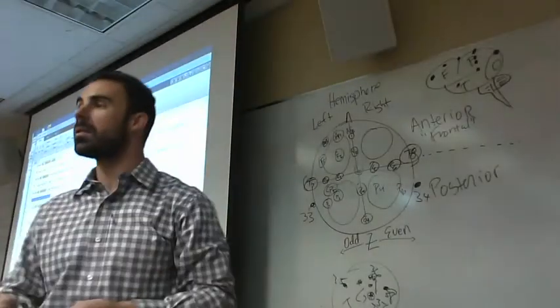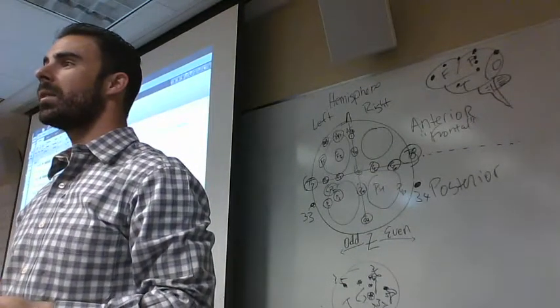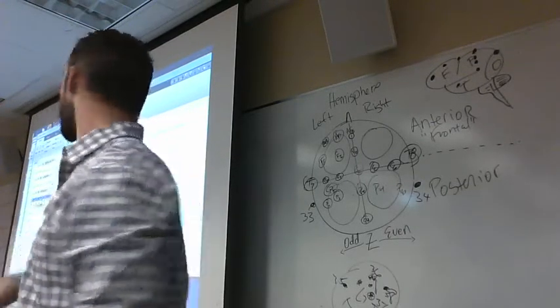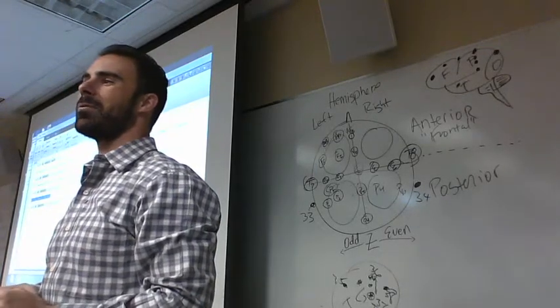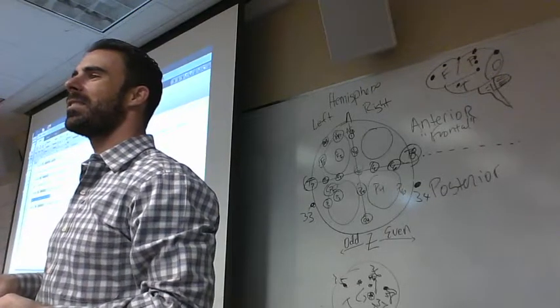You know how whenever we type in EEG, there's not 2 lines, there's a bunch of lines? You only select the bottom 2 right now? Well, because the other ones are the top ones that we've already grabbed. You can highlight them all if you want and paste them back in. It's going to look just like this, though. You load it in, BioSig, we reference to 3334, basic filter, 0.1 hertz.